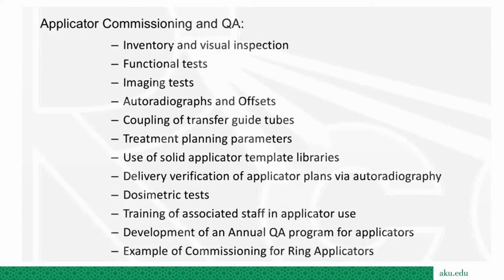Similarly, there are treatment planning parameters associated with the applicators. So it is advised that we place a sheet for every applicator in the treatment planning system so that we can use this sheet while doing the planning. We'll be talking about this in the following slides. And there is an option that you can use the solid applicators out of the library templates. So we will touch a little bit on this as well.